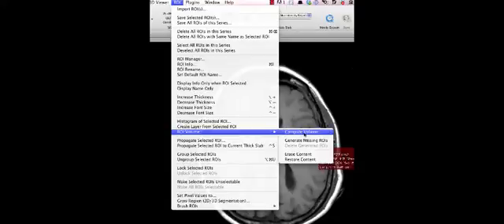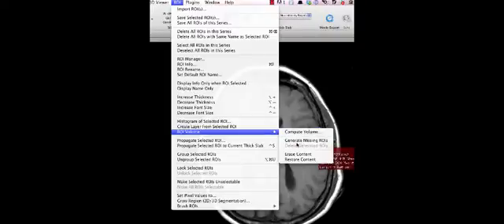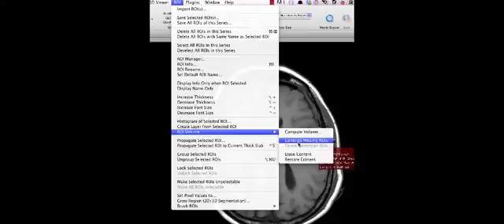Just before I do that I just want to show you the option generate missing ROIs. You remember that in this particular example I highlighted all the regions of interest. But you can also miss a couple of slices and then name all of them with the same name and then use this function to generate the missing ROIs. So it can help you to quicken it. So now we will get back to the main tutorial.